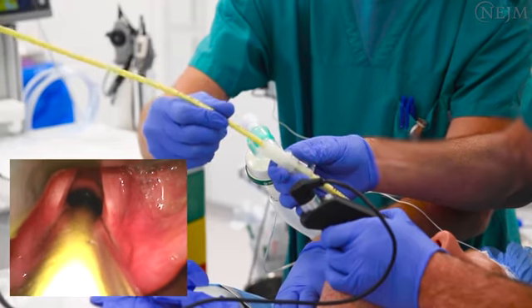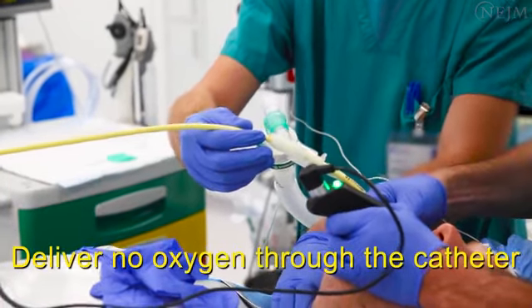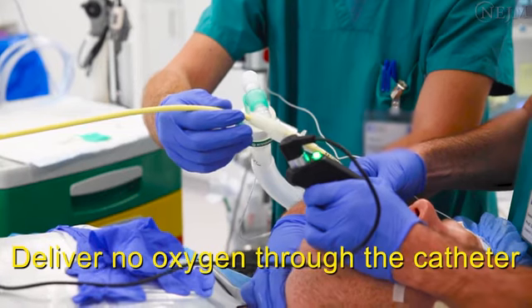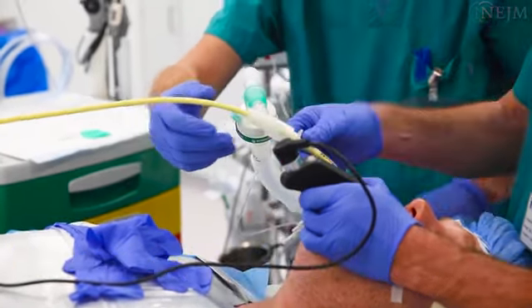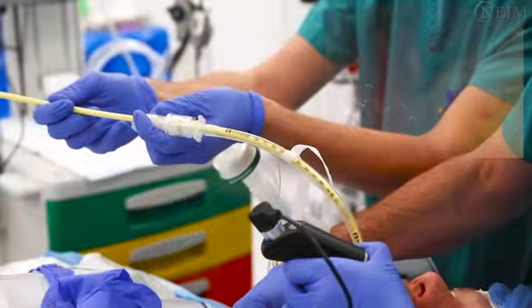It is important to avoid delivering oxygen through the airway exchange catheter because that can lead to barotrauma if the tip of the catheter becomes accidentally placed in a bronchus and causes occlusion. Then, deflate the cuff of the oral tube that is currently in place and remove the tube.